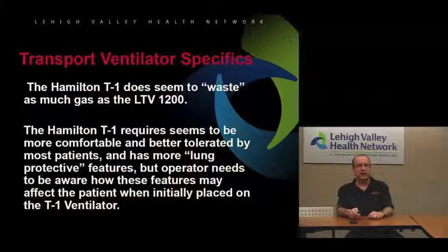So side by side on the same patient or person, i.e. me, it actually did ventilate me with the same volumes at a much lesser pressure, and it did feel more comfortable. So objectively, that's how I can kind of tell it seems more comfortable for the patient. And presumably more safe since it's at a lower airway pressure.